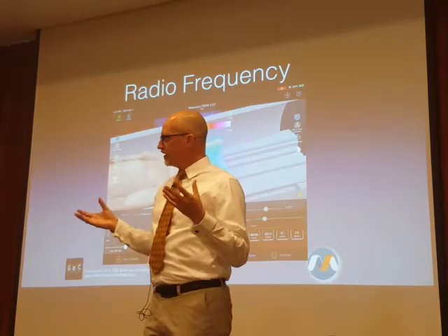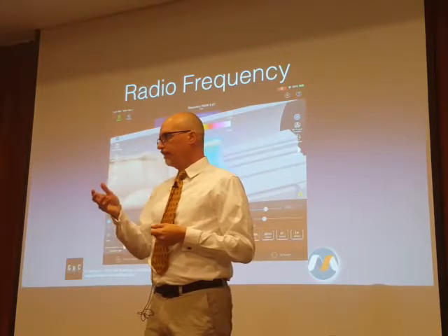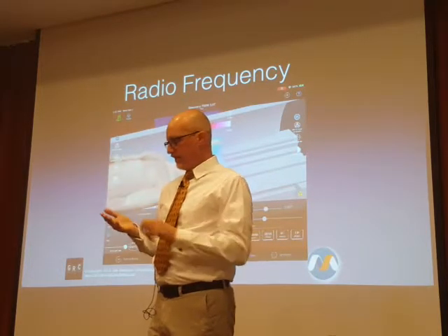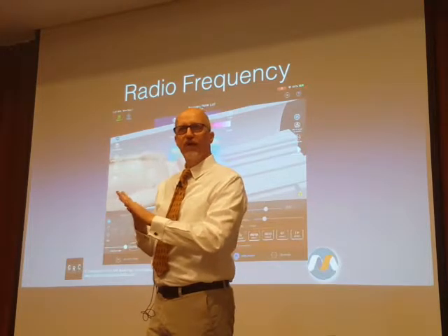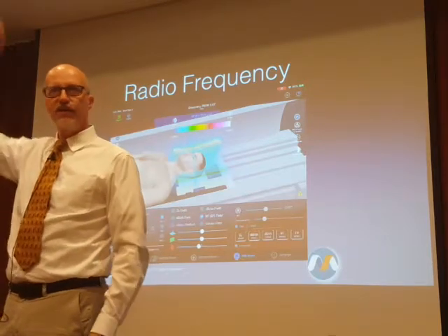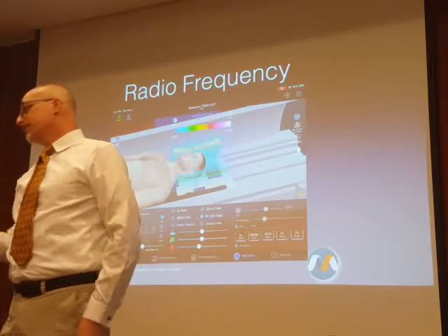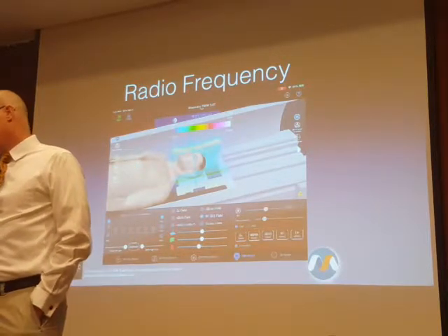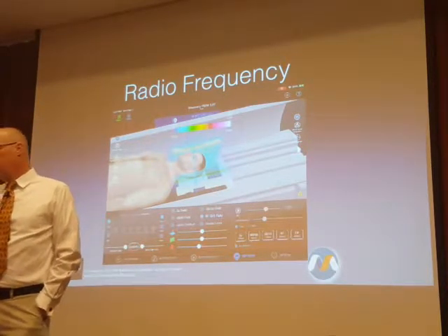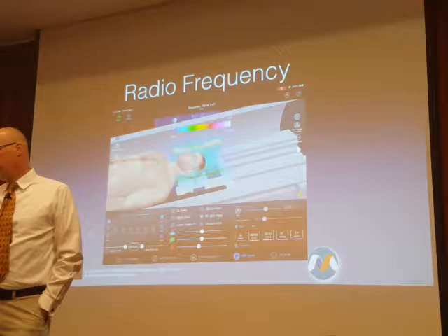How many of you have had the experience of an old incandescent light bulb? You turned off the light and you went to unscrew the light bulb. I burned my fingers like crazy when I was a teenager, thinking, oh, you just flip the switch, and then you can unscrew the bulb right away. Those incandescent light bulbs are 60 watts, 100 watts. If we take our 100 kilogram patient at 2 watts per kilogram, we're sending 200 watts of power into that patient.